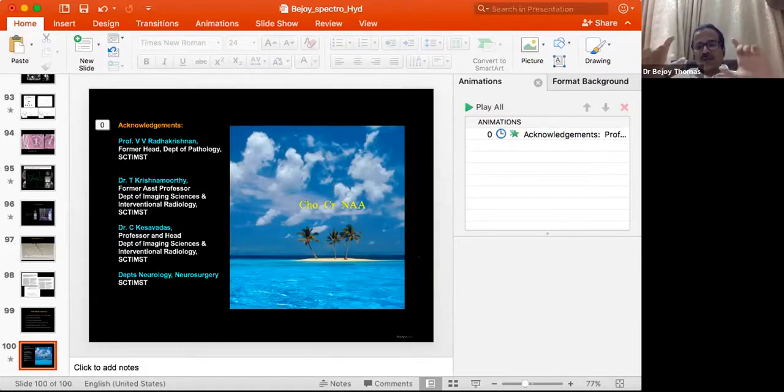So when you see no creatine, you can actually do that. When you see creatine, you are no longer interested in continuing. You can just take a screenshot and stop. So in less than 1 minute, you are actually making a diagnosis. Most people will wait for everything to come. So the MR is actually a very versatile machine. We are not even using 1% of the capability.